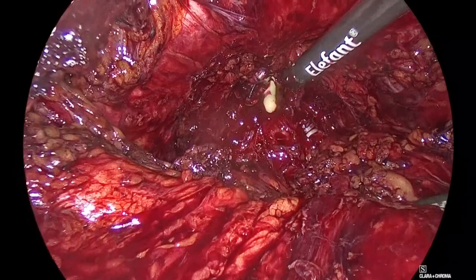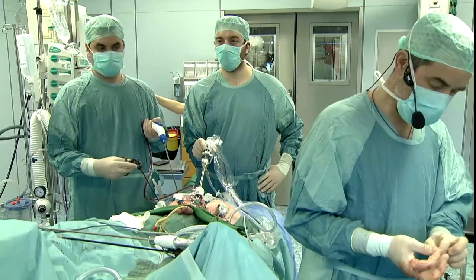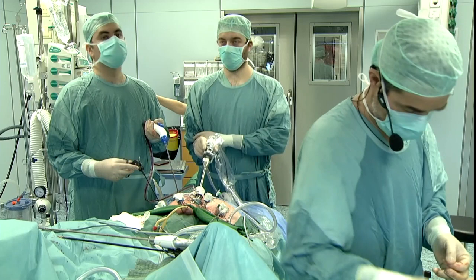So I'm just cutting at the end, and I'm making a knot at the end of it, so I can really use it as a fixed point on my needle holder.